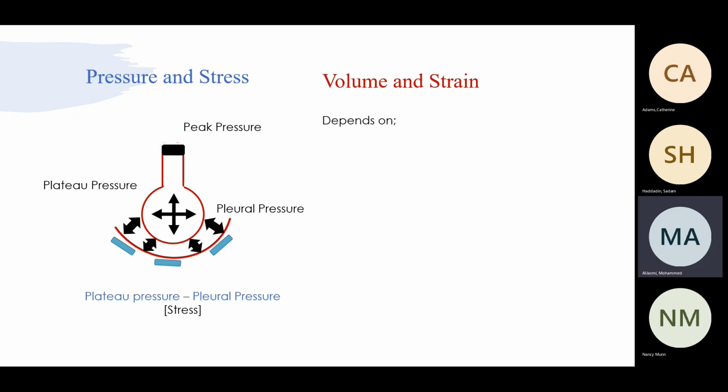Strain depends on the tidal volume. So we said tidal volume, and I mentioned functional residual capacity. Is that right? So if I would like to give you enough volume, that should be calculated according to how much lung you have. Is that right? I cannot just decide now. All of you started from Dr. Becker going there. Okay, I will start 500 cc in all of you.